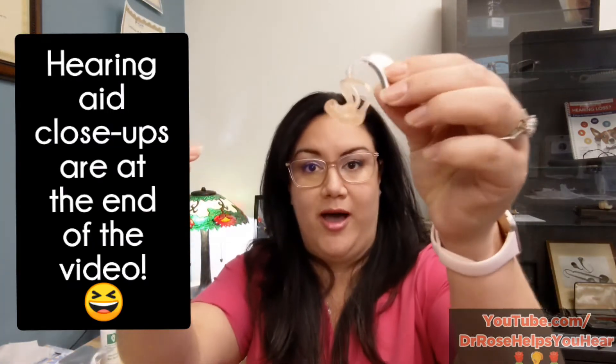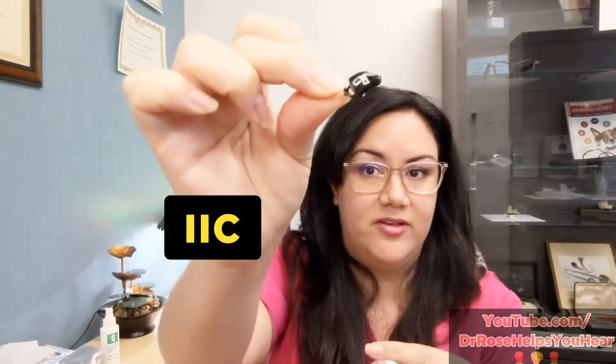We have a few different hearing aids today. I've got a behind-the-ear hearing aid, an invisible in-canal hearing aid, and a demo receiver in-canal hearing aid. This one has a custom ear mold tip.